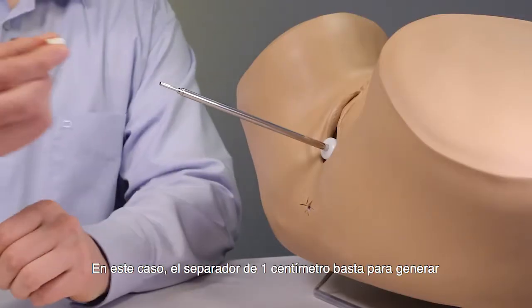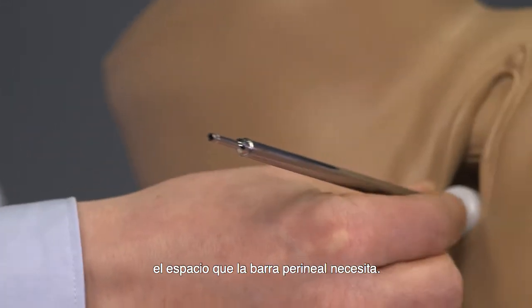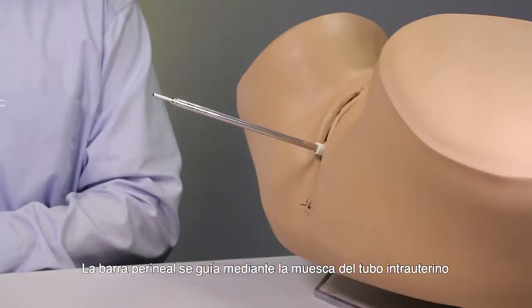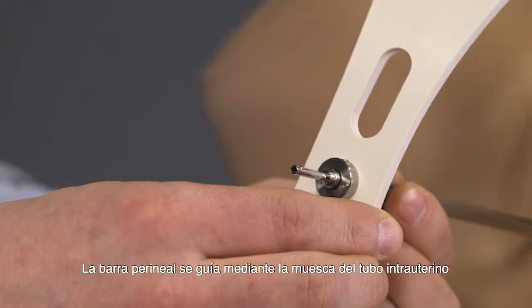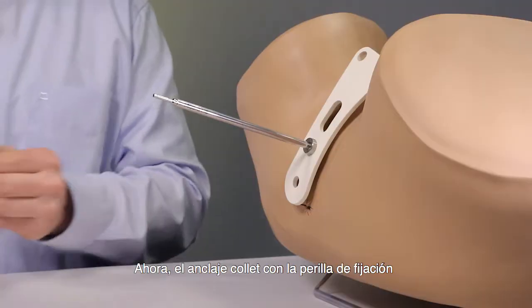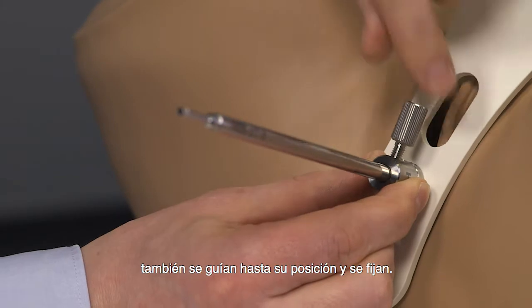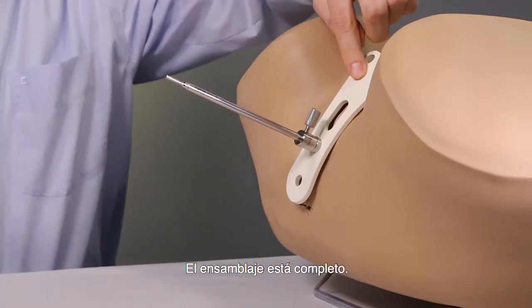In this case, the spacer of one centimeter is sufficient to allow enough spacing for the perineal bar. The perineal bar is guided alongside the groove on the IU tube into position. Now the collet sleeve with the collet lock knob is also guided into position and can now fix the assembly. The assembly is now complete.